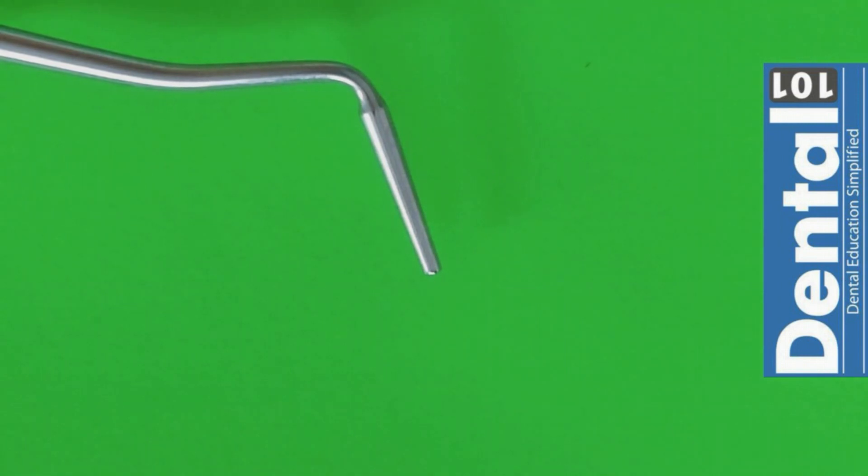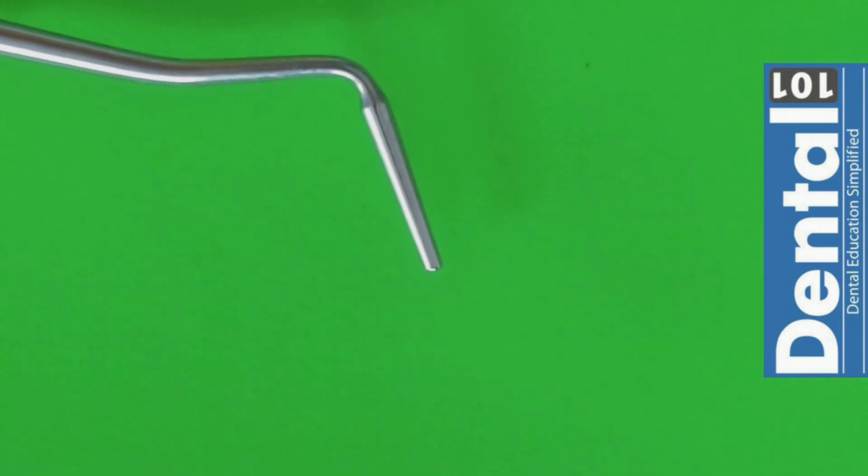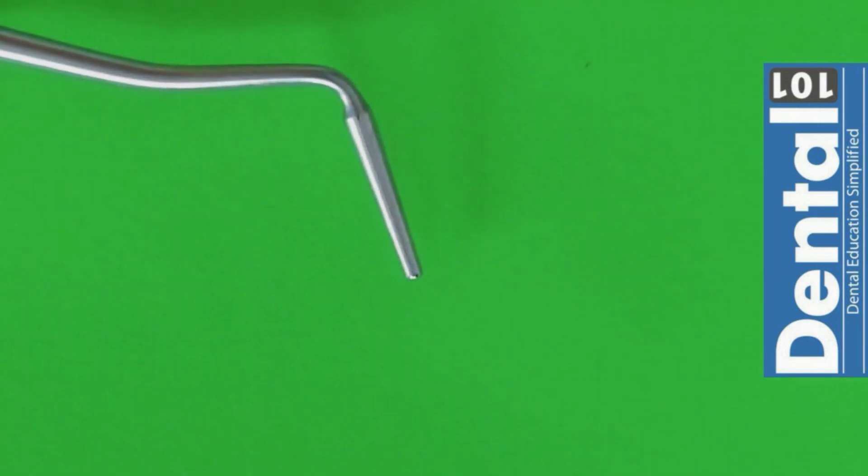Okay guys, so now taking a closer look to each instrument. Here we have the Martenson plugger. This is a double-ended instrument and it's basically used to condense any amalgam or any other restorative materials such as composite.